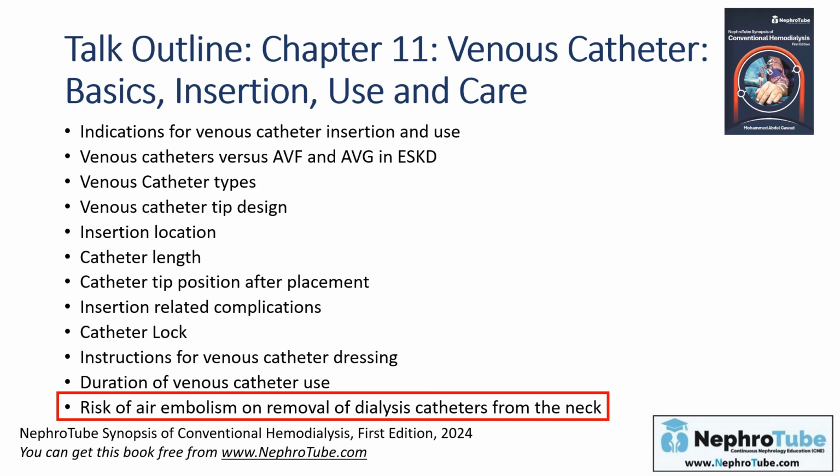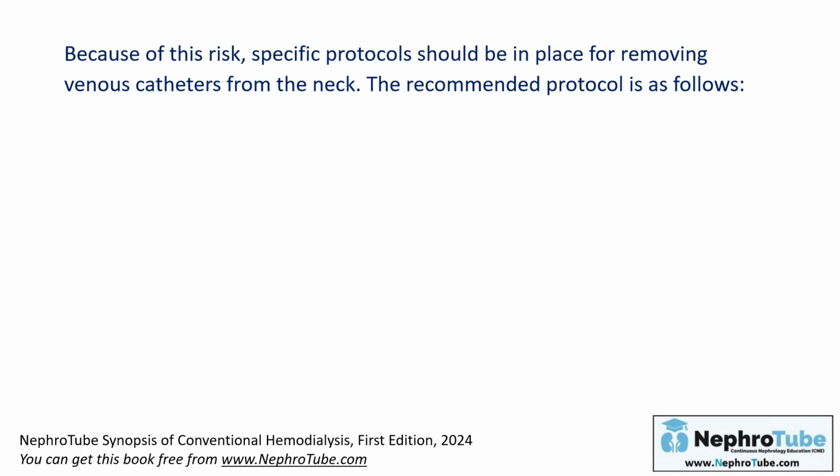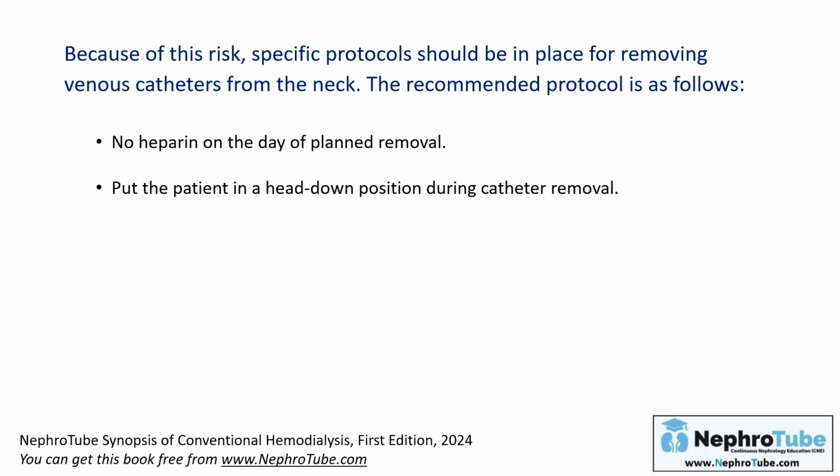Finally, we have to mention that there is a risk of air embolism on removal of dialysis catheters from the neck, and this may be lethal. So to avoid this, you have to follow these instructions. First, no heparin should be used in the hemodialysis session on the day of catheter removal.